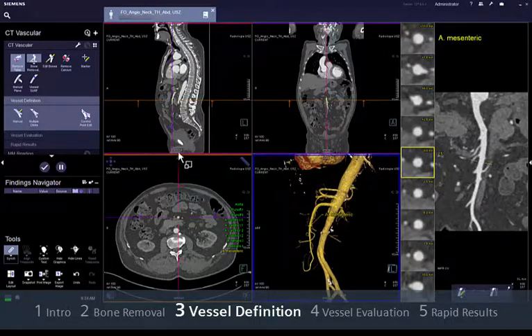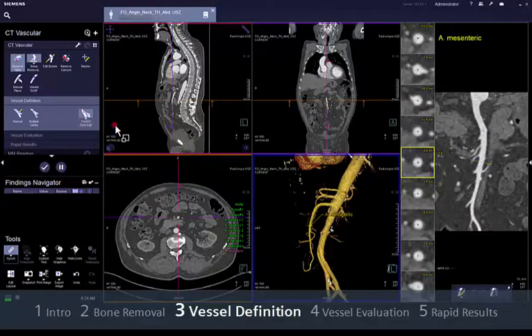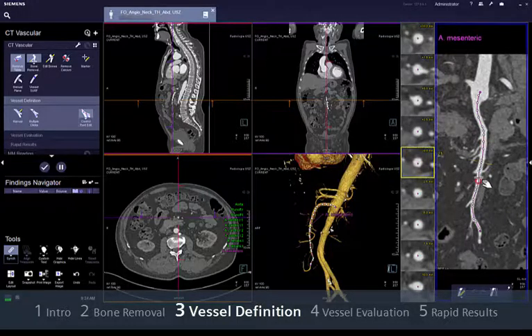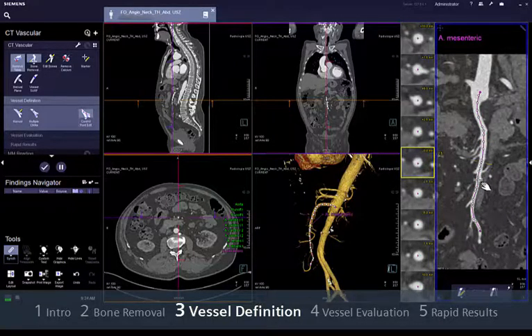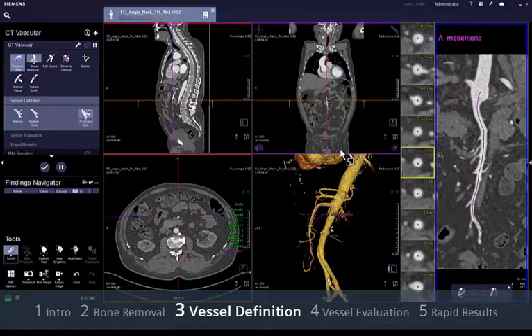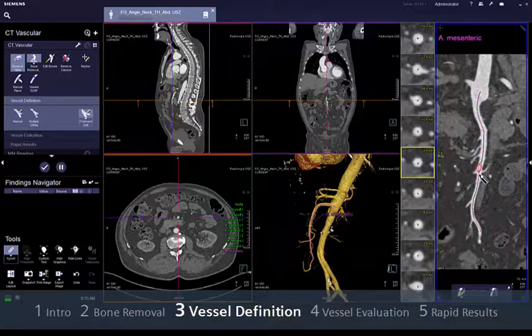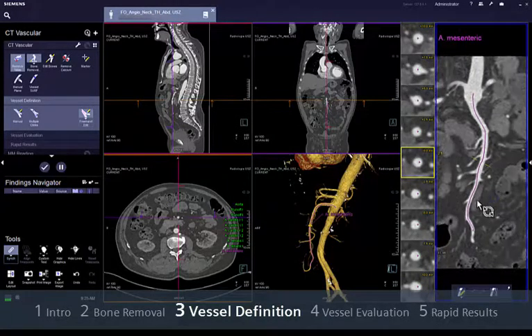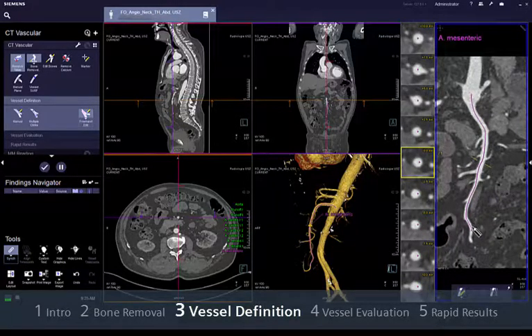To correct existing centre lines, Syngovia offers you two modes: Control Point Edit and Freehand Edit. The first mode allows you to modify the centre line by moving, adding or deleting the control points that define the path of the vessel. With Freehand Edit, you can manually redraw the path of the vessel as you wish. Remember to go back to the centre line once you have overcome the area you want to correct, otherwise the remaining part will be excluded.